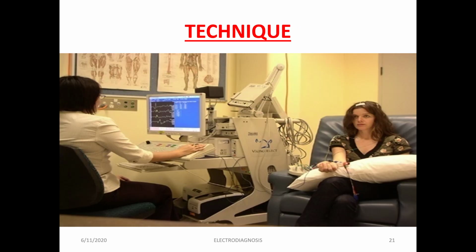Now the last investigation done by this particular system is the evoked potential. But frankly speaking, no one is doing this evoked potential, because we have other investigations already existing for the central nervous system. Generally we rely on MRI and CT scan, mostly on MRI. But still we can have a look at this. There will be stimulation at one point and it will be recorded at 4 different points. Depending on the location of recording, we will have different graphs on the screen.